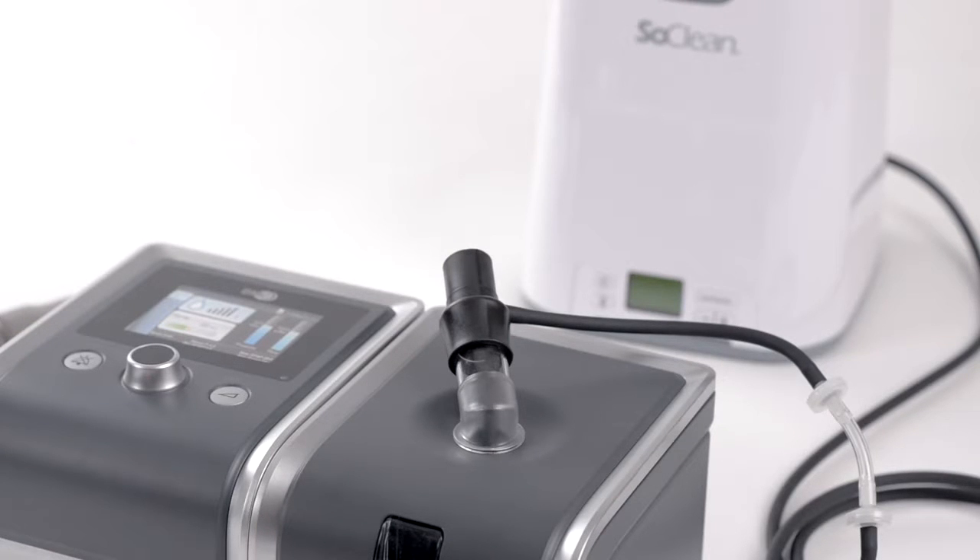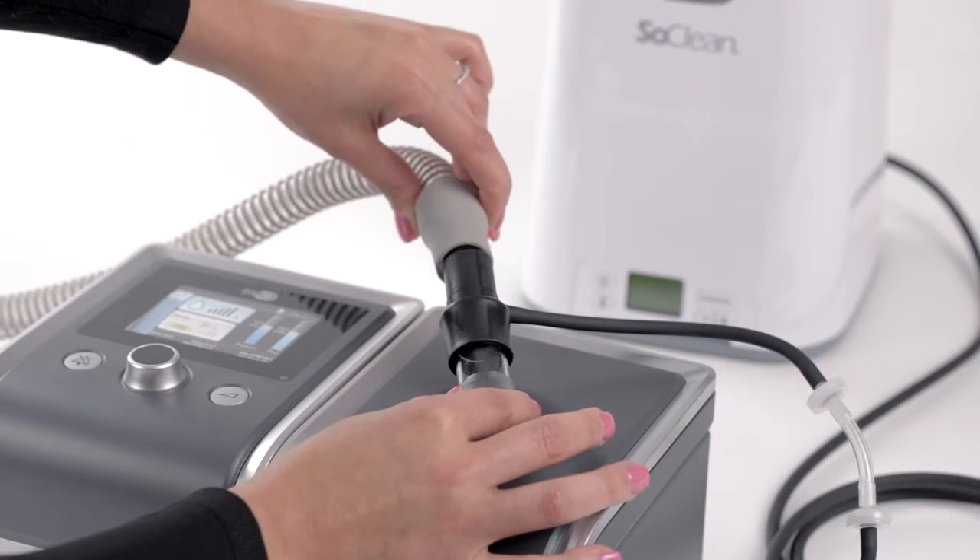If necessary, carefully trim the injection tubing in increments until it is the correct length. Now connect your CPAP hose to the end of the injection fitting.